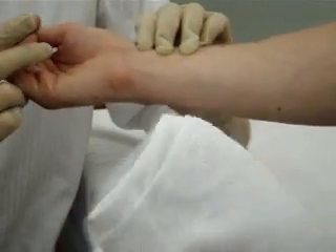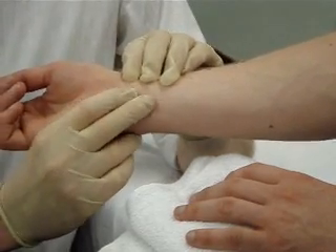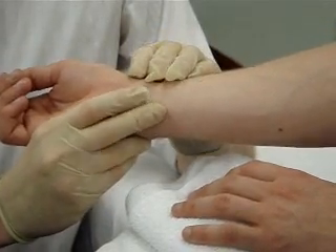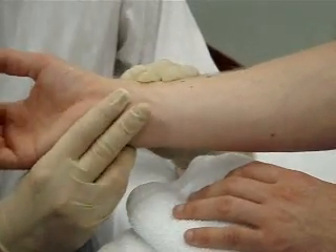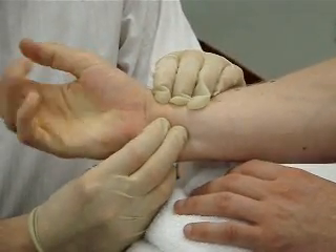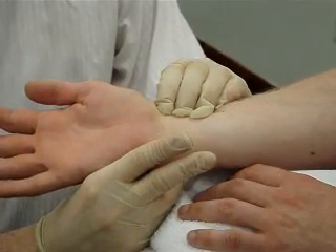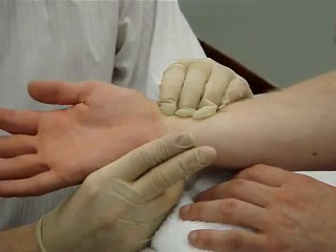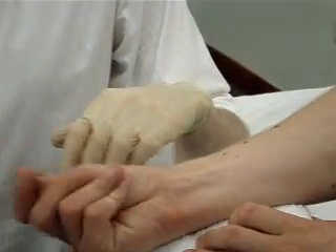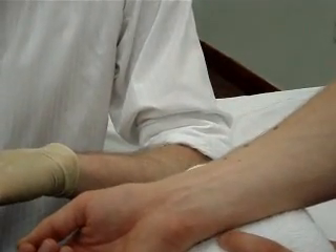So one of the tests you can do is just palpate the radial artery — it's easily palpable there. You can also palpate the ulnar artery, and there's something called an Allen's test where Ben can just clench his fist very tightly and then open it out. As you can see the hand flushes very easily — that is whilst I've occluded the radial artery. It's a very nice demonstration of a normal Allen's test, meaning he's got a good collateral ulnar blood supply.